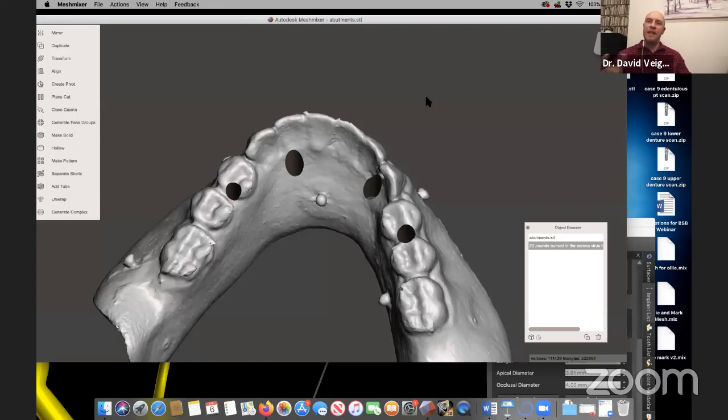Because what will have happened, as someone said earlier, is that there will be shrinkage, there'll be movement, whatever. And what will happen is those implants and the prosthesis, if they're held together still with the screws, the implants will have integrated, and that restoration will have still been sitting in position. So the implants, if it was tight, will have moved into that bridge, if you will. They'll have come together. So now I've got that beautiful restoration that's completely passive on those implants.